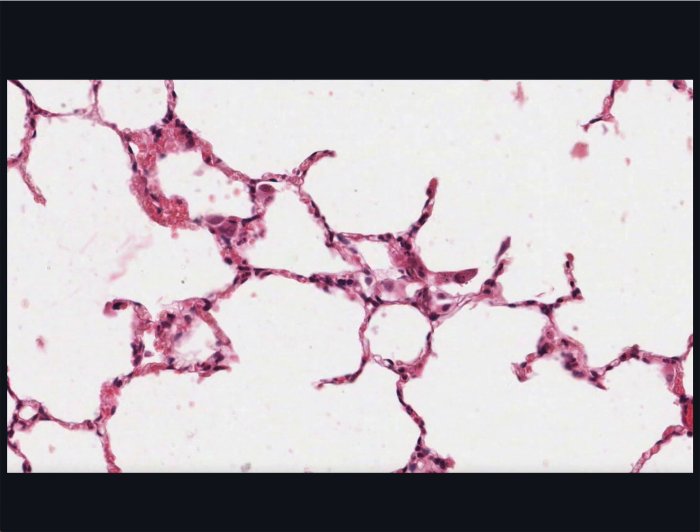The many elongated nuclei belong largely to type 1 epithelial cells, or type 1 pneumocytes, and endothelial cells. It is not possible for you to distinguish between these two cell types. You can see many red blood cells in the capillary lumens, or perhaps in larger lumens of venules.